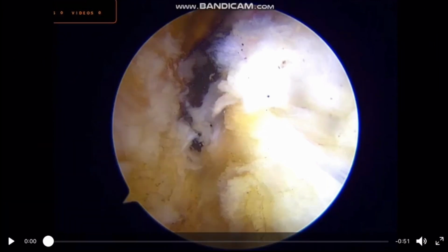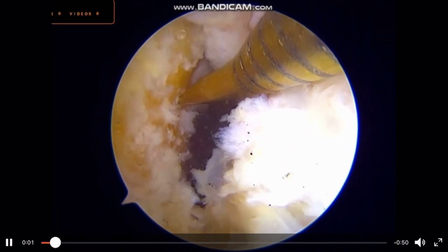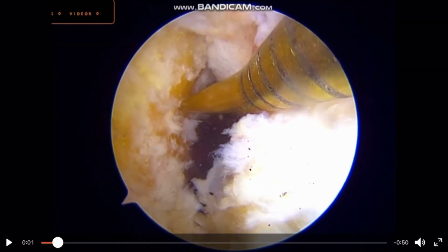There are a lot of techniques to make the femoral tunnel. What I will be showing here is the tunnel through the medial transportal technique. Here I am viewing through the anterolateral portal, and you can see here this area is divided into high, which is above, to this is low, and this is deep to superficial.